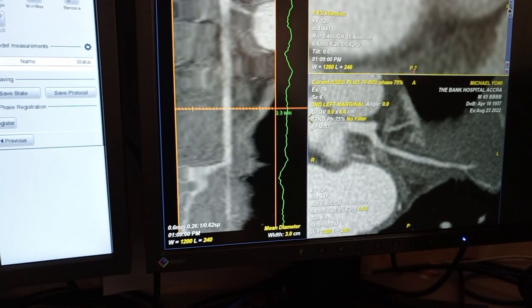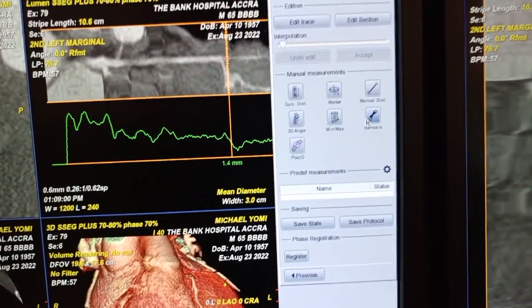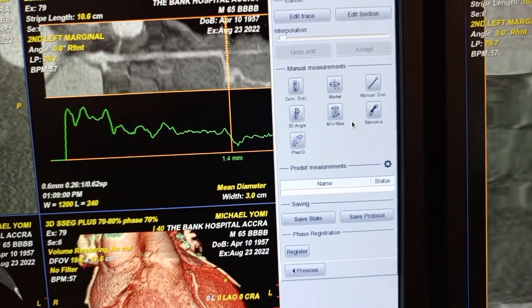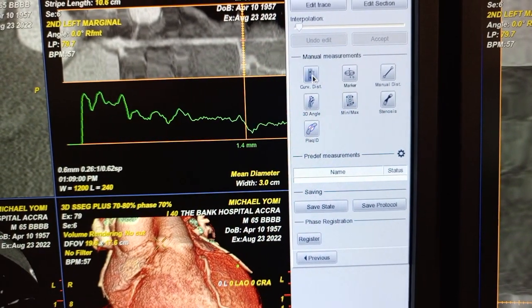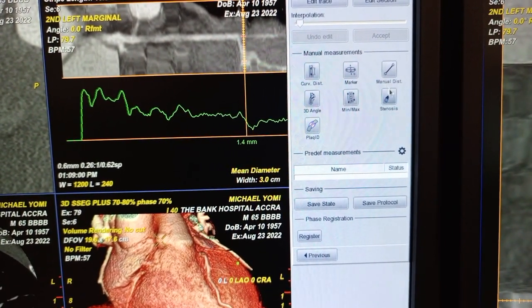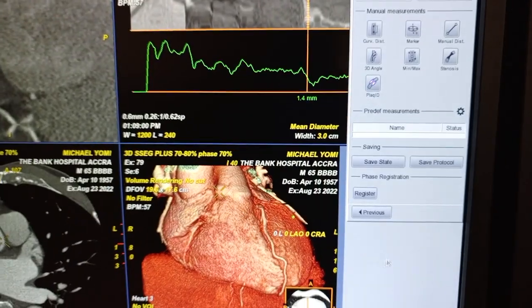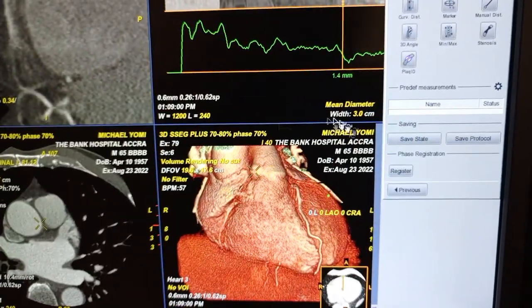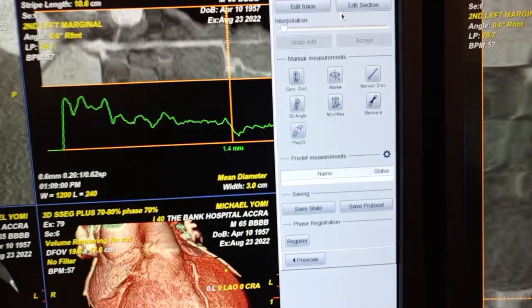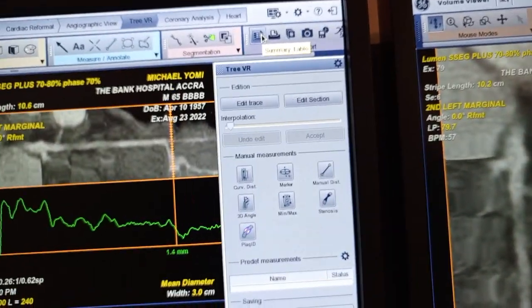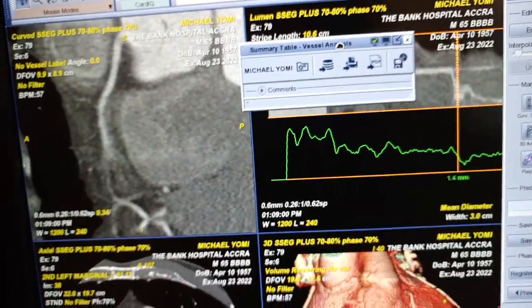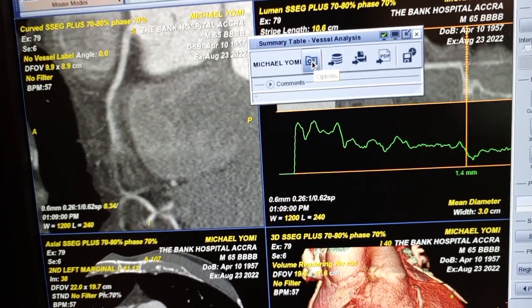You can go through right now to see the stenosis. Here you can measure if there is any stenosis, any plaque with 3D angles, or manual distances. What you can do next is go to what we call the Summary Table at the top. When you click on it, it gives you the vessel analysis platform to save what you want to save.